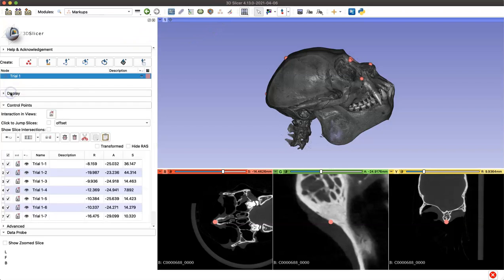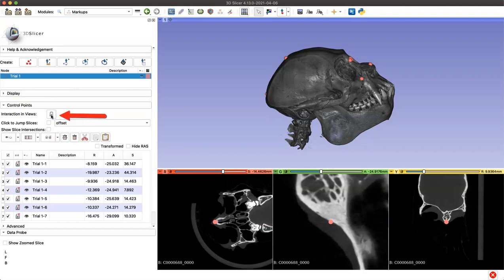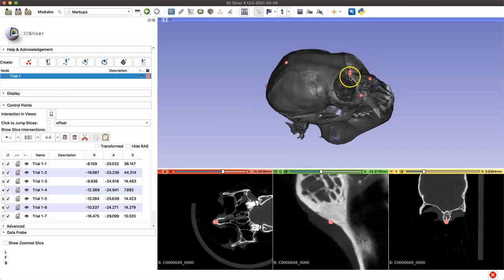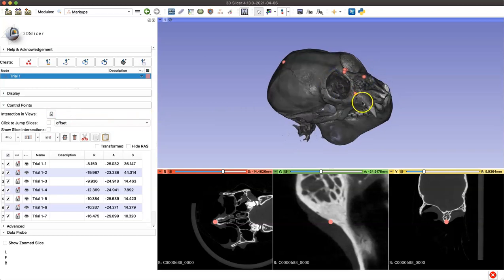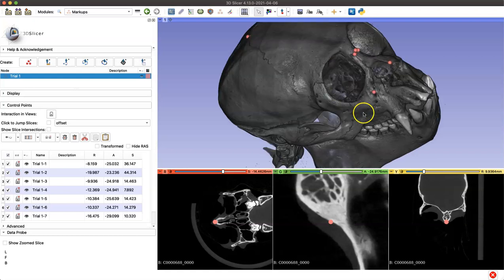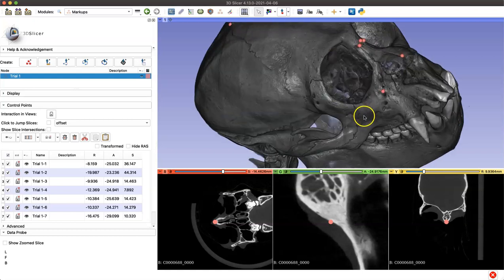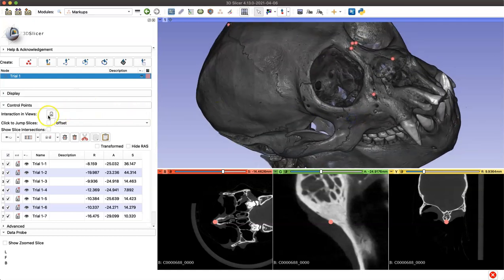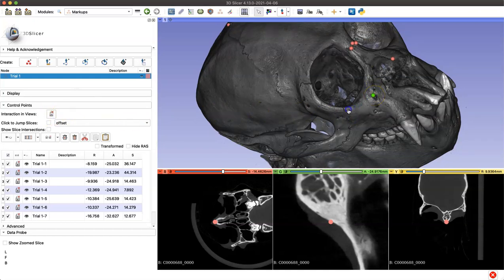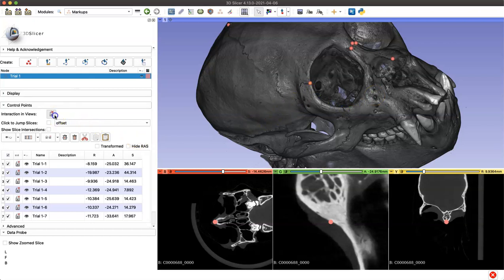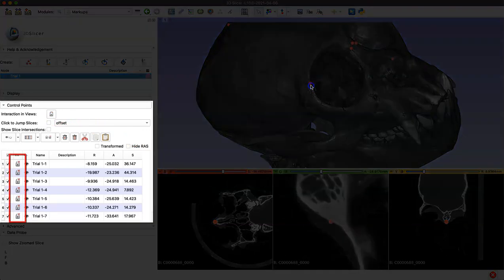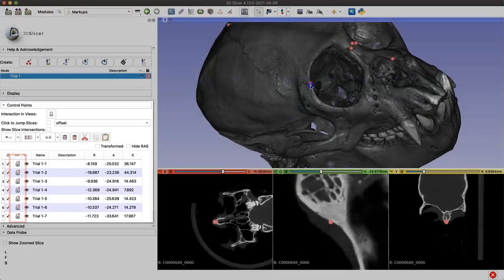Under the control point drop down menu, you can use this lock feature to freeze your points on your model. This is a really helpful feature so that you don't accidentally grab one of your landmarks and move them when you don't mean to. Normally if you hadn't locked your points you'd be able to adjust them by just clicking and dragging, but here I'm going to unlock them now and move that point. It's going to turn green and now we're able to move them again. Now I'll lock it and I'll be unable to move them. You can also lock individual points, whatever is most helpful for your workflow.